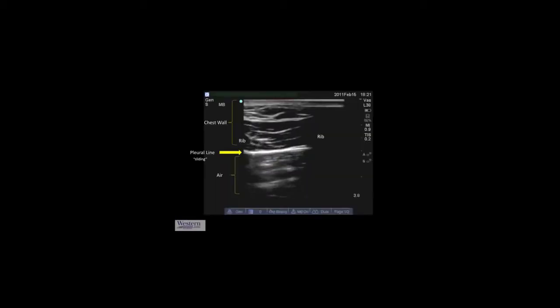First, the sagittal projection across the ribs is going to show you this type of picture. And in this screencast, we're going to show you a lot of vascular or linear array images just because they're more vivid, are better for teaching purposes. But in practicality, as I spoke in the last screencast, we tend to use a phased array probe most often.